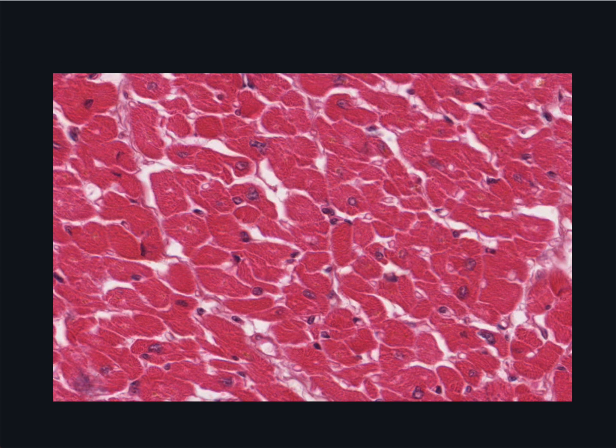The myofibrils are readily apparent as red profiles packing the cell's cytoplasm. They are ribbon-shaped instead of rods, as is the case for skeletal muscle. Cardiac muscle cell nuclei are large, pale, and, as you see here, are located in the middle of the cells. Quite a few other smaller nuclei lie in the connective tissue spaces between the muscle cells.